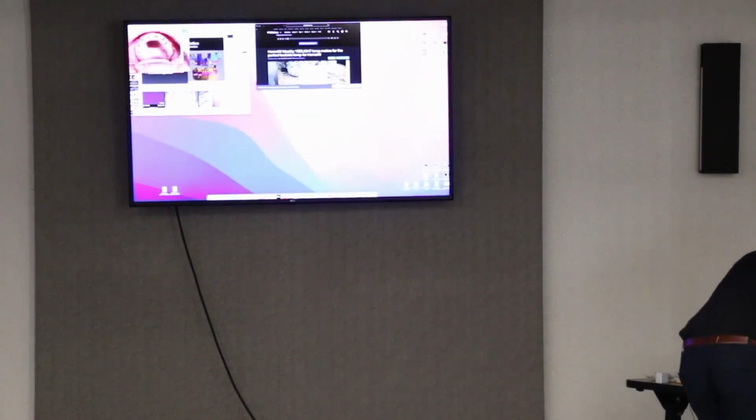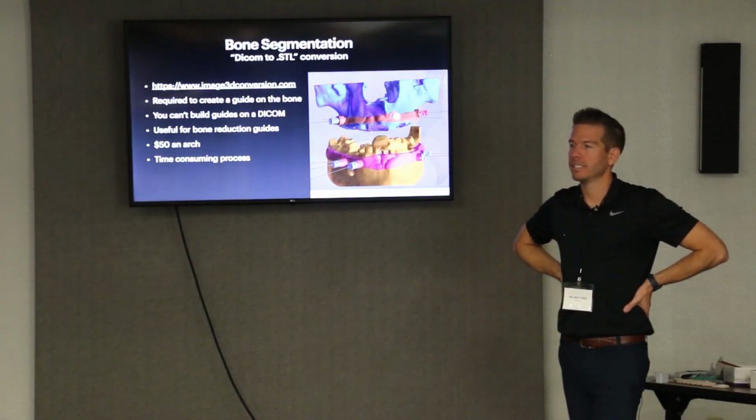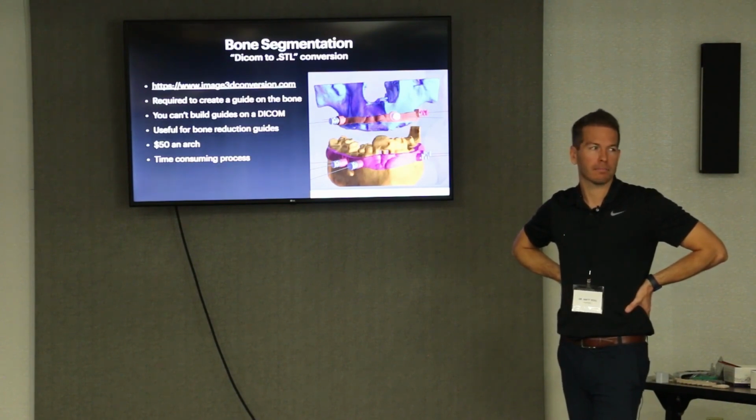Really thin ridge. I mean, yeah. I do those, 3 O's in a ridge where you can seriously see paper thin both sides. Where I can see both sides. Yeah, that's probably not a good guidance case. Yeah. If it's so thin, you can't just trust the guide. Yeah. You have to almost freehand that. Yeah. You have to be really careful in those cases. I totally agree. A slide or two of applications with thin ridges and deflection and everything too. Nice. Yeah, those aren't easy. Yeah, the guides take your visual ability away.